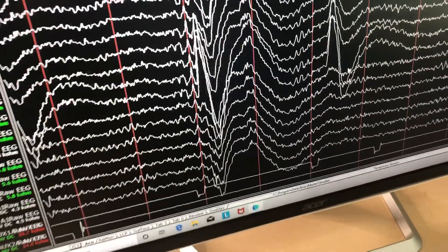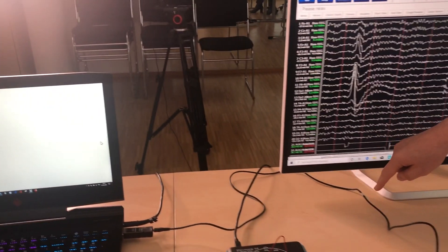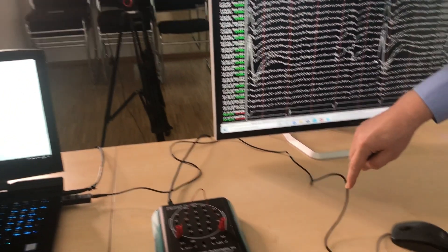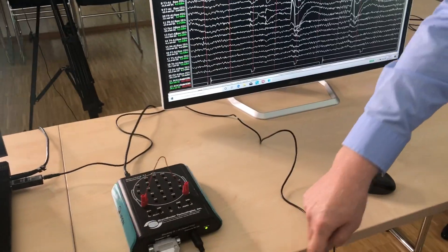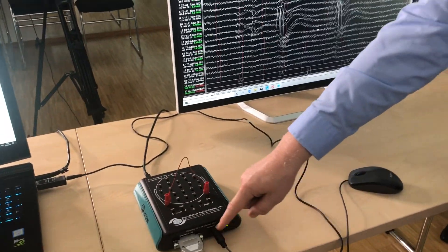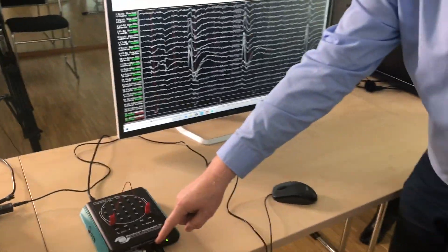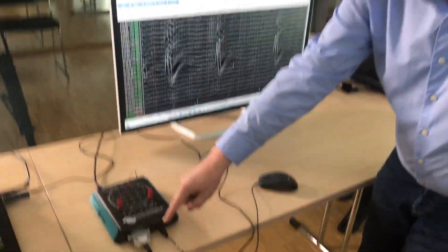Now, this is the echo — here, and here, and here — from the trigger stimulus.